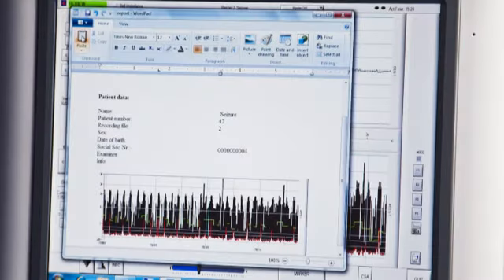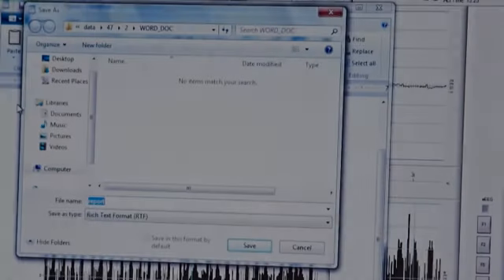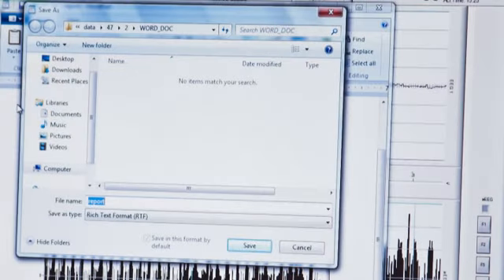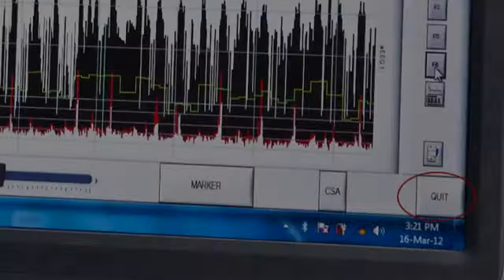You can then save the document directly to the network, send it to a printer, or save it on the computer hard drive to be reviewed later. Click save to save in the desired location.